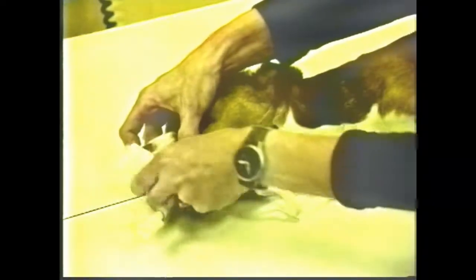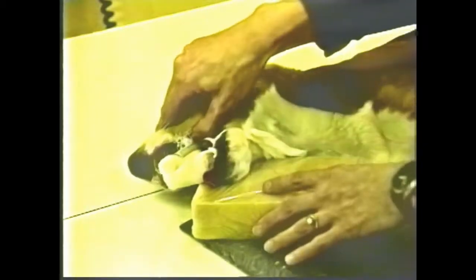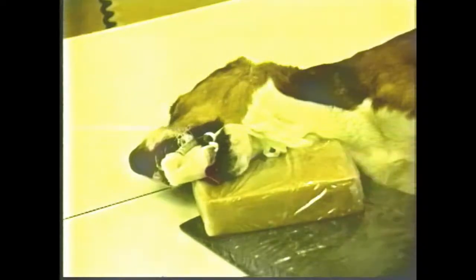The maxilla was not well visualized on the oblique mandibular view. To visualize the maxilla, the rotation of the head must be made around the axis of the nose. The mouth is held open with the gauze, and the mandible is elevated to create the rotation around the center point of the maxilla. Markers must be placed properly, and the animal must be turned over and the view repeated to visualize the opposite side.